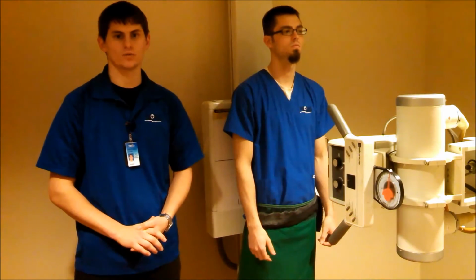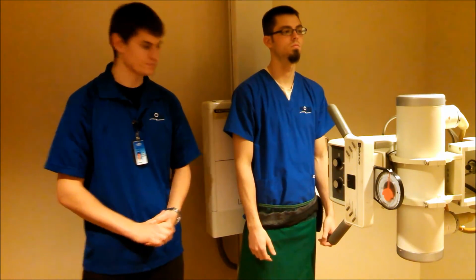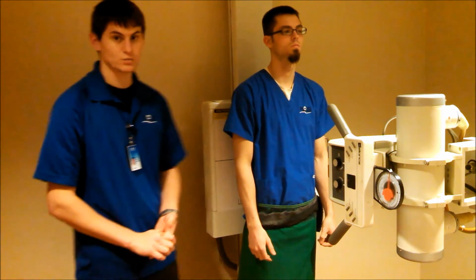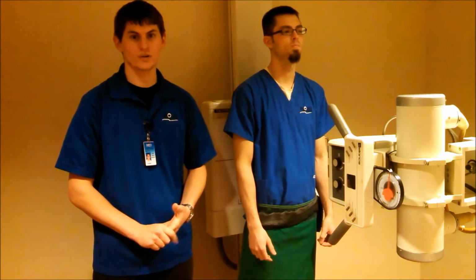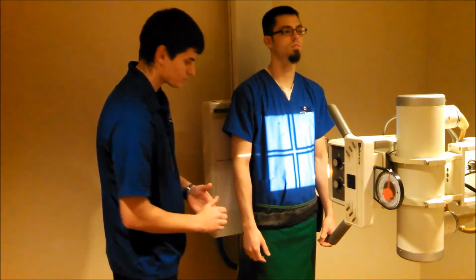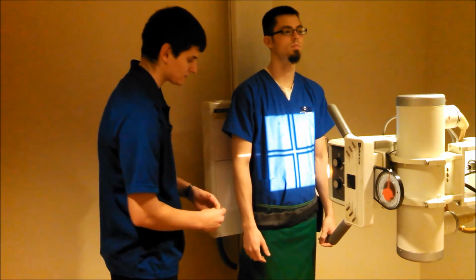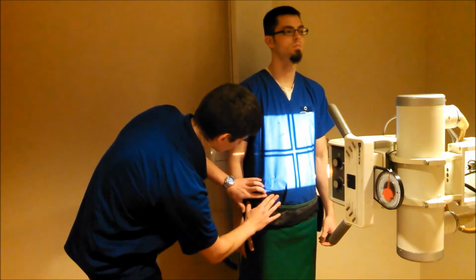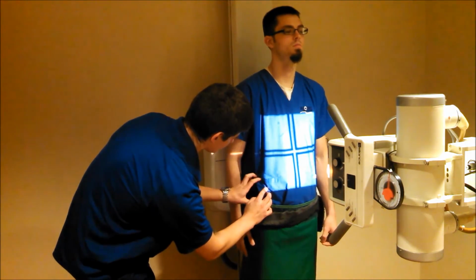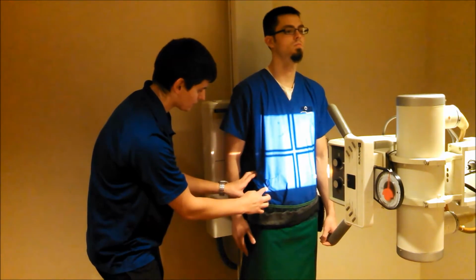The next projection that we are going to do is the AP upright abdomen. As you can see, we already have our patient shielded. Next we're going to line the tube to the part. In order to do that, we need to find the anterior superior iliac spine. So we're just going to palpate for it there. Then we're going to roll up with our fingertips and find his iliac crest, top of the crest.